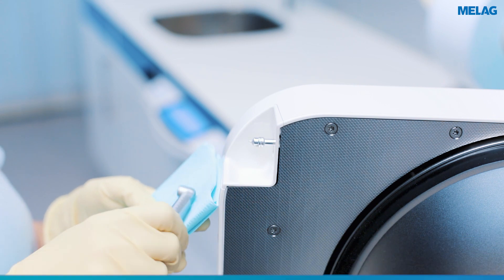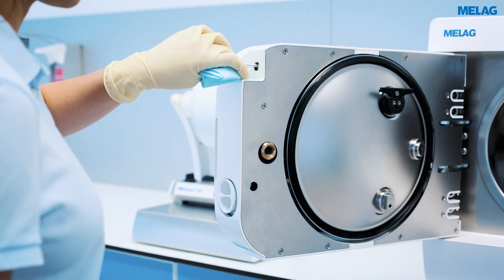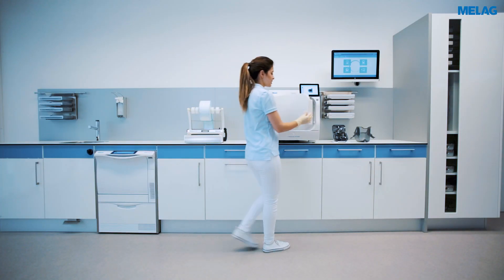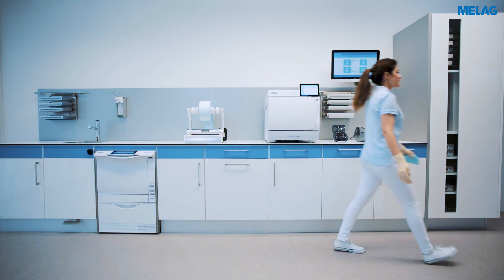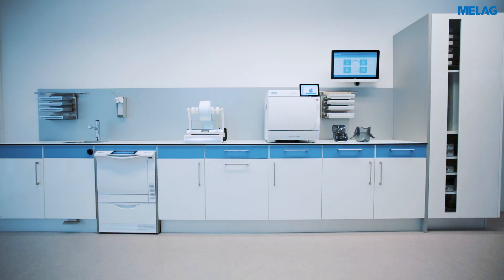You can clean the nozzle and the collecting tray with a dry and lint-free cloth. Finally, deactivate the chuck care function, either via the display or by closing the door.